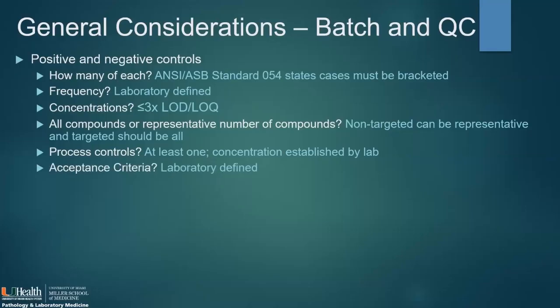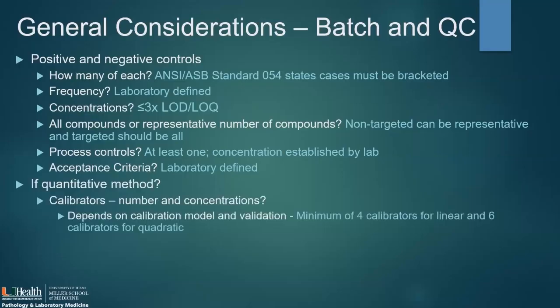Acceptance criteria for your positive and negative controls. Once again, laboratory defined. So anytime we see this laboratory defined, it just means that it needs to be in the policies and procedures, but it's what the laboratory can meet themselves and what they choose to have, as long as it's within reason.